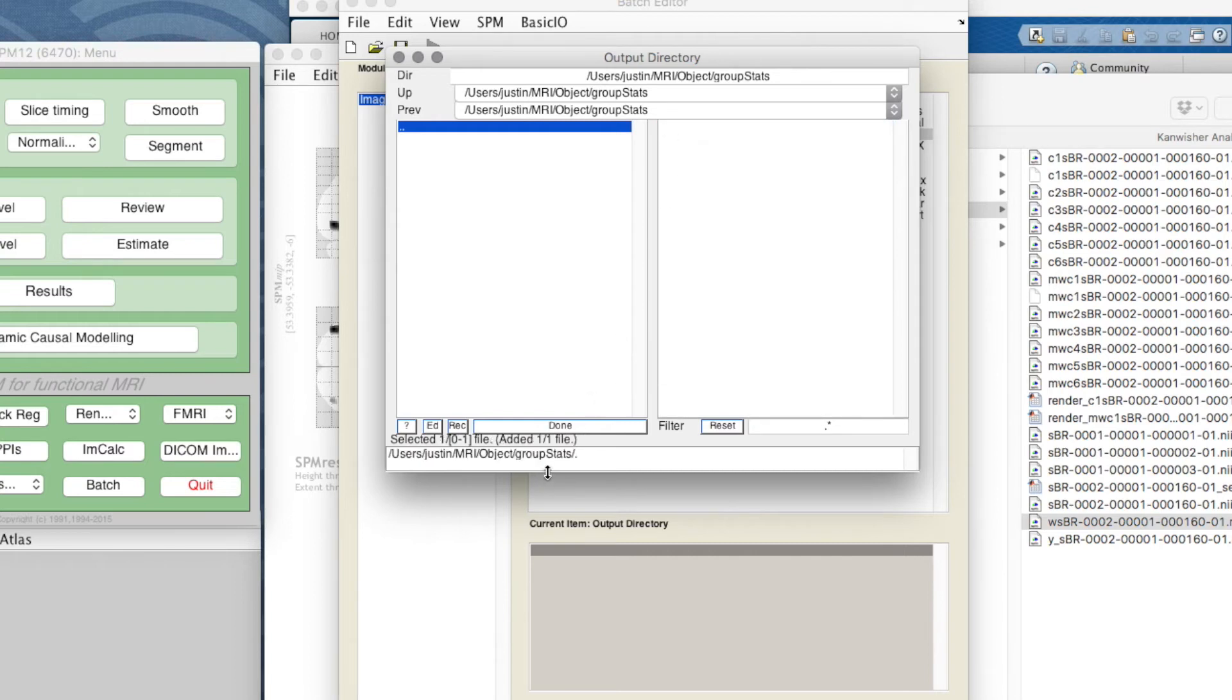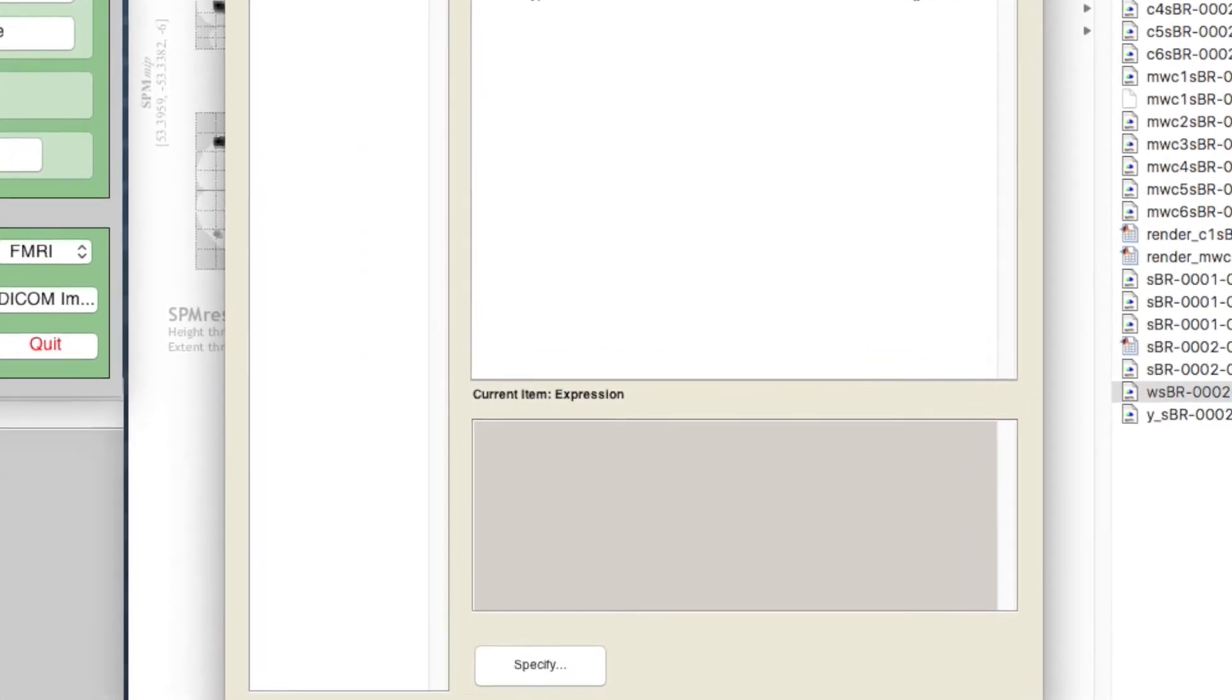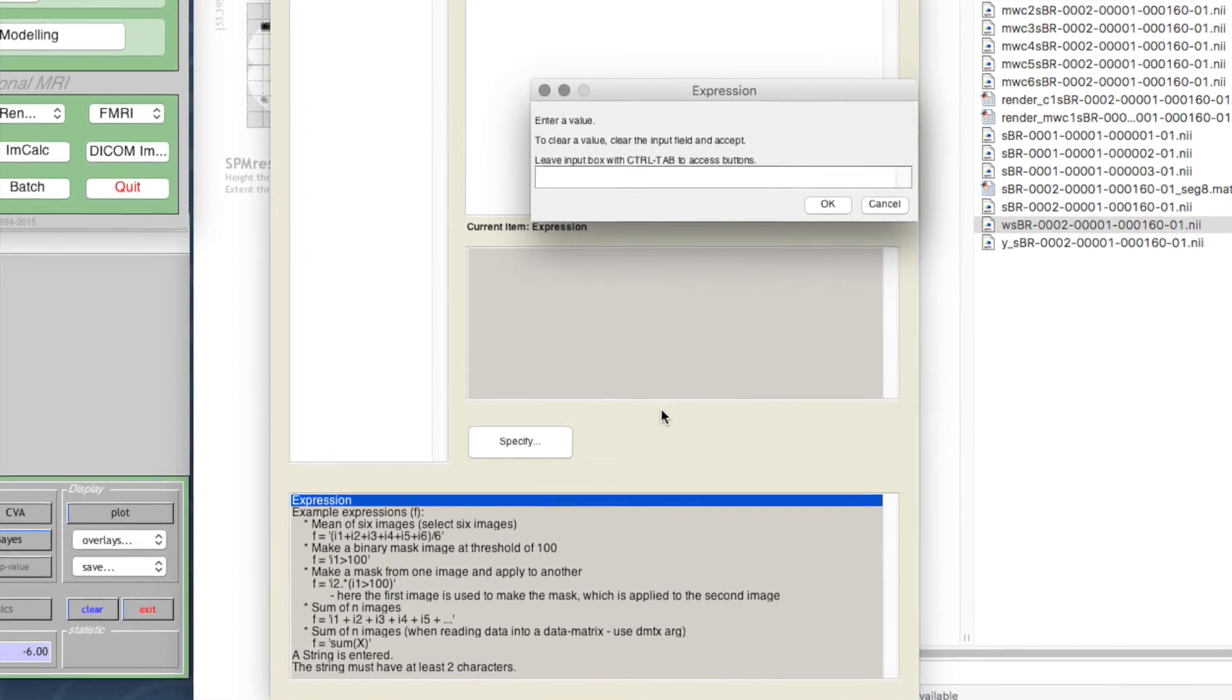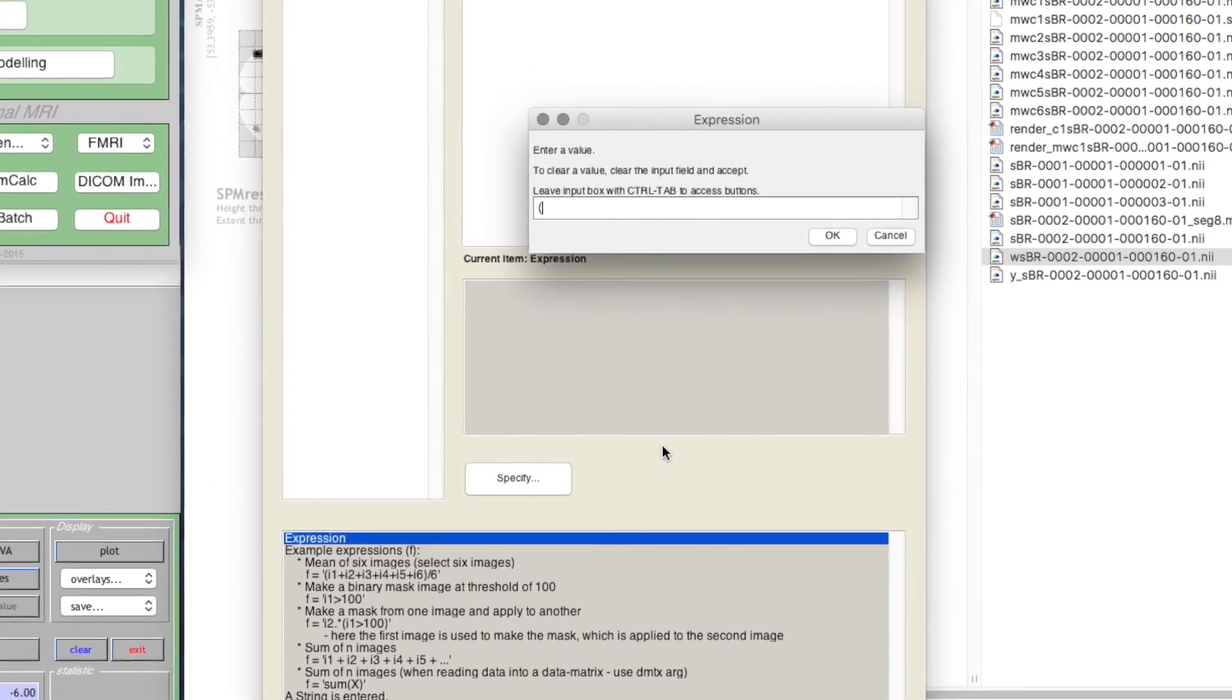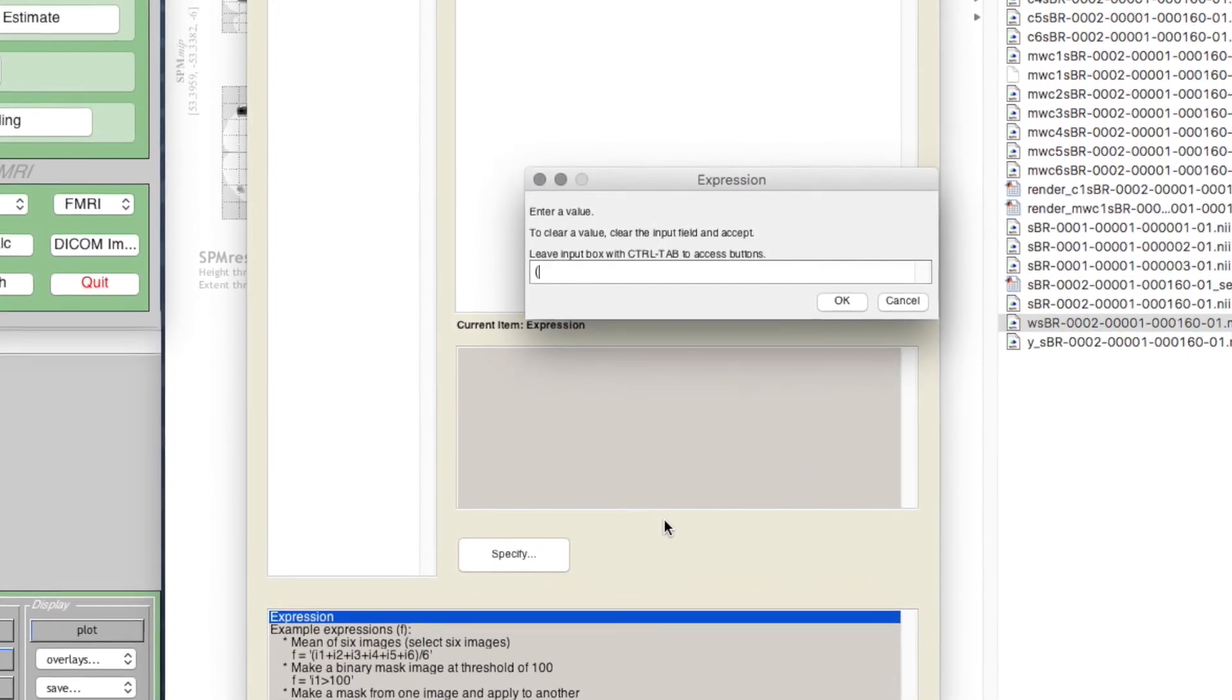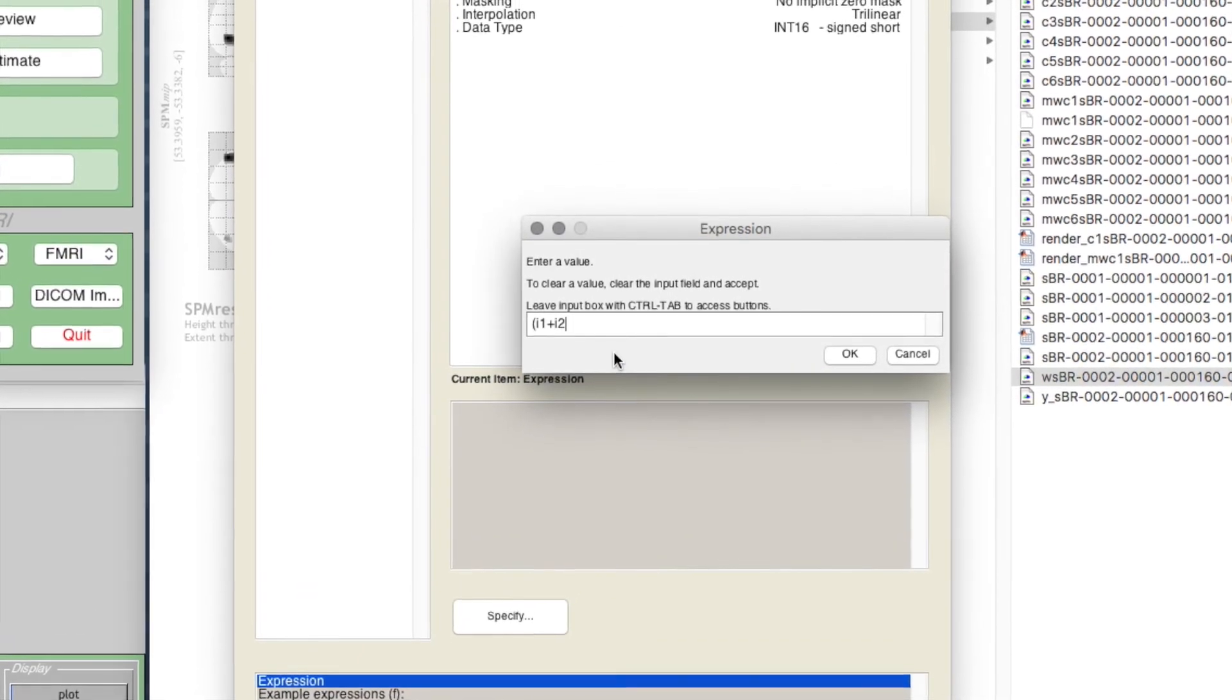Now we have the expression, which might seem intimidating, but it's actually very easy because we just look to the contextual help at the bottom and it gives lots of examples. I can specify the expression - this is just an evaluated MATLAB expression where the different images are i1, i2, i3, etc. To make a mean of the images, the example is given here: you could just put (i1 + i2 + i3 + i4 + i5) / 5.